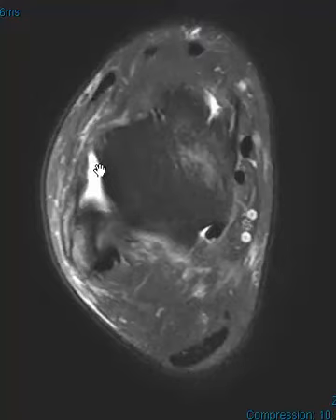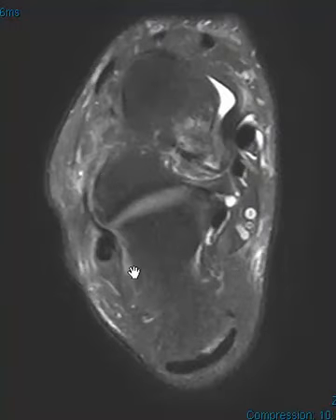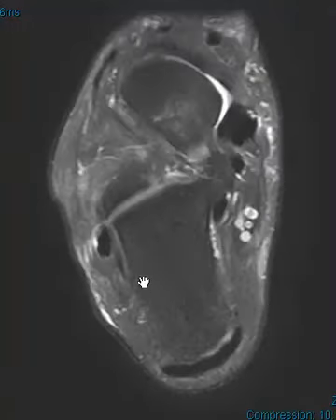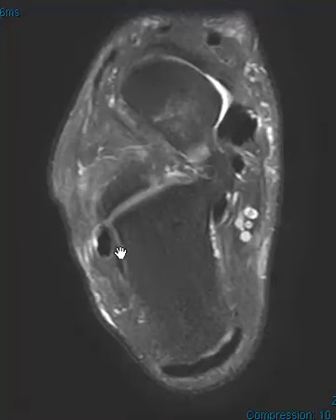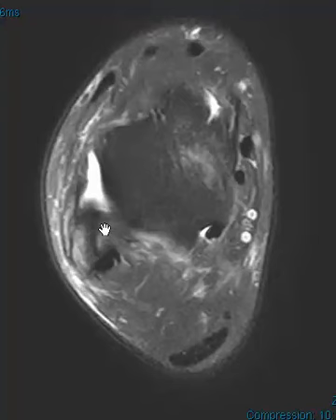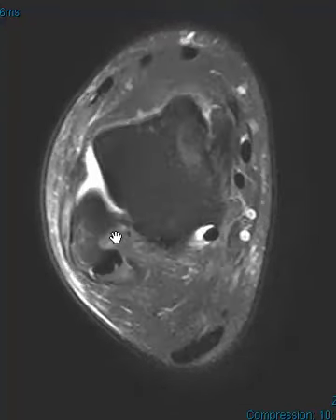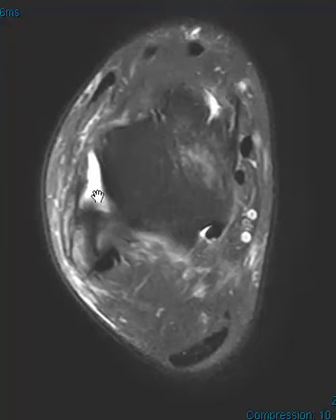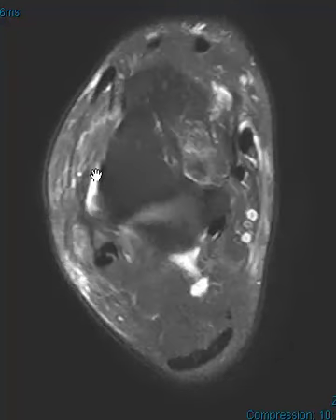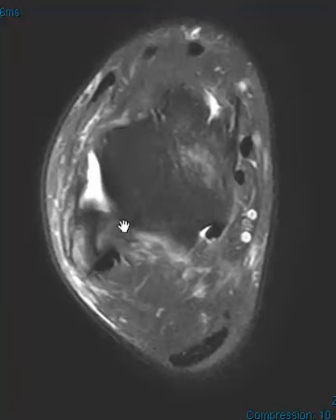And oftentimes the calcaneofibular ligament will also be torn. The calcaneofibular ligament is very small and hard to see, but this is it right here coming off the back, and it comes forward underneath the peroneus tendons right here. And it comes sideways — we should be able to see it come up attached, but this is also torn. We can see that a little bit better on the coronal images. So again, this is a classic tear of the lateral ligament complex with the anterior talofibular ligament rupture and calcaneofibular ligament rupture.